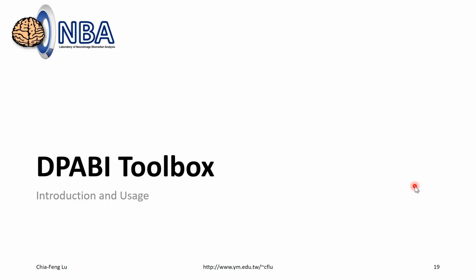Okay, now in the second part, I'm going to introduce this toolbox called DPABI. This is one of the toolboxes that actually combines SPM12 as well as the resting-state analysis that we introduced in the first section.